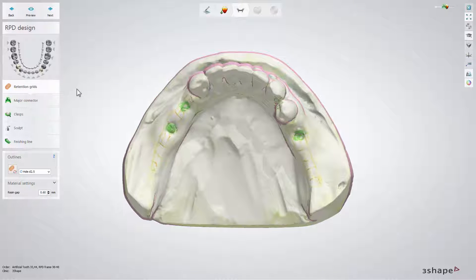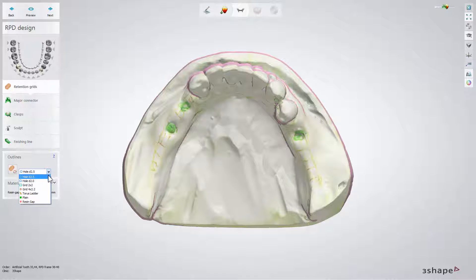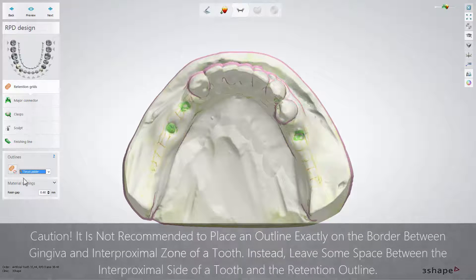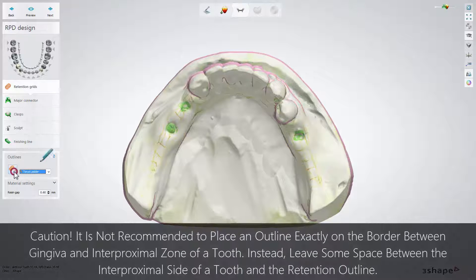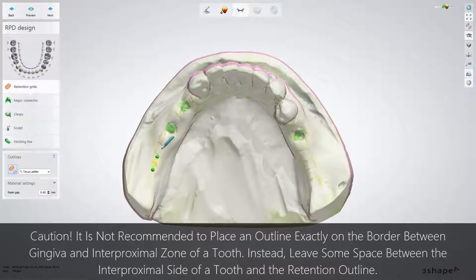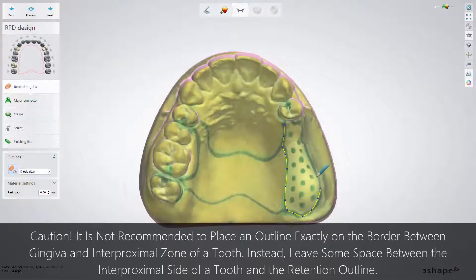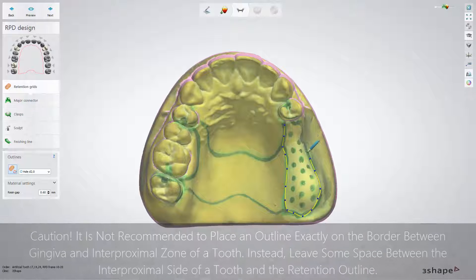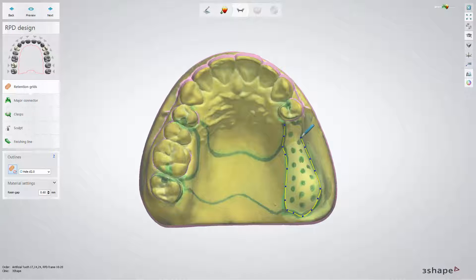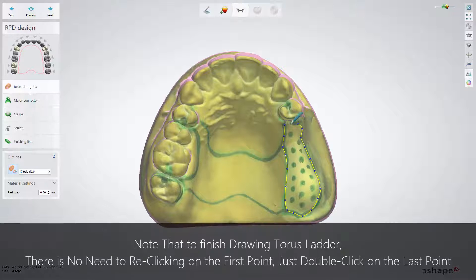Start with the retention grids. Select the type you want and click the Draw Retention Grid Outline button. Move the mouse cursor to the model and start drawing the outline. To finish drawing, put the last point on the first one.